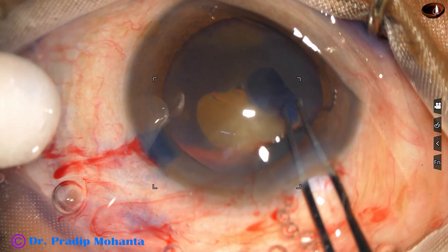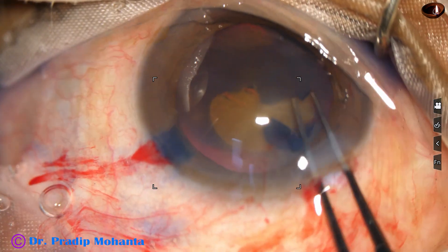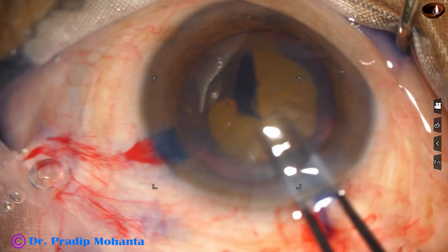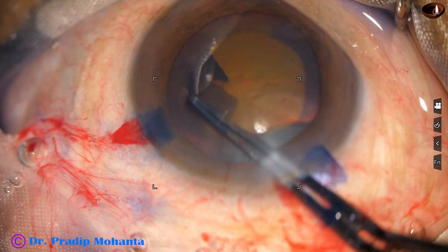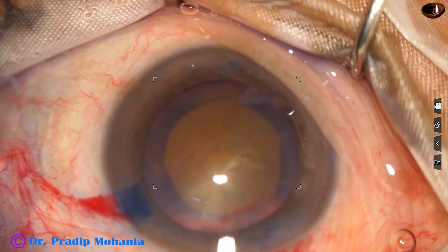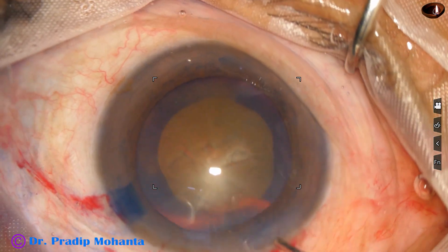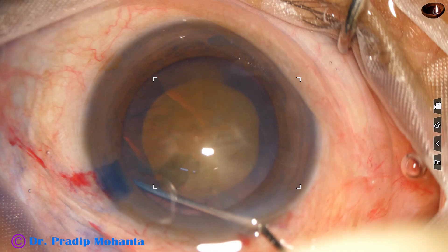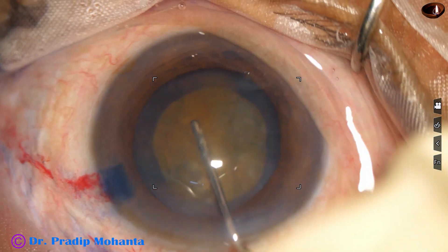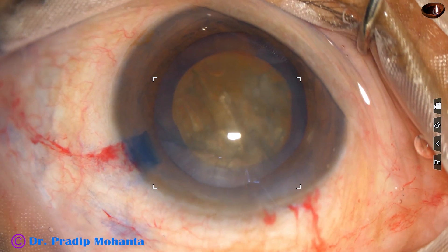I take the Utrata again and complete the rhexis. The rhexis is not circular but it is continuous, fairly centered and optimum sized — about 5.5 millimeter. In hard cataracts, size of the rhexis should be 5.5 to 6 millimeter.